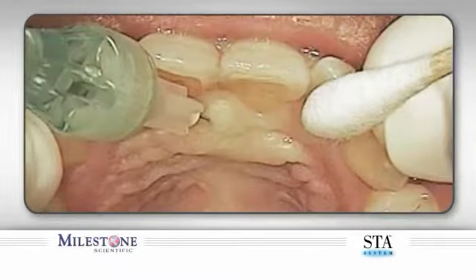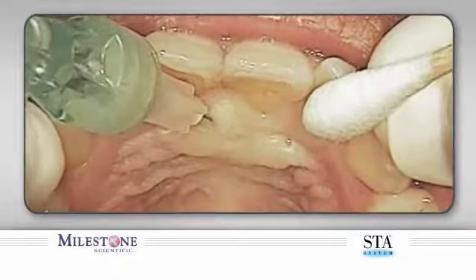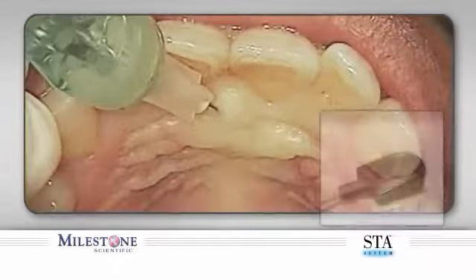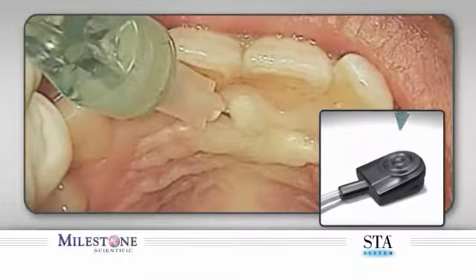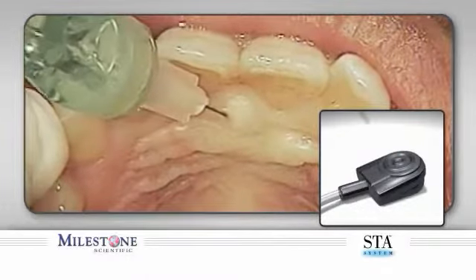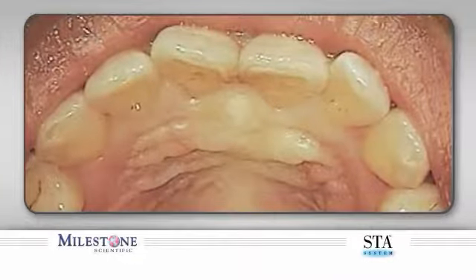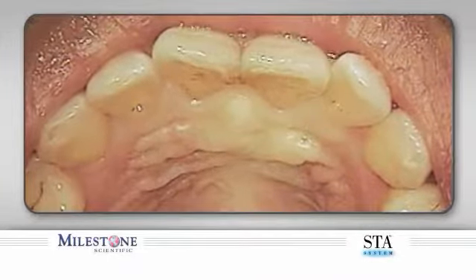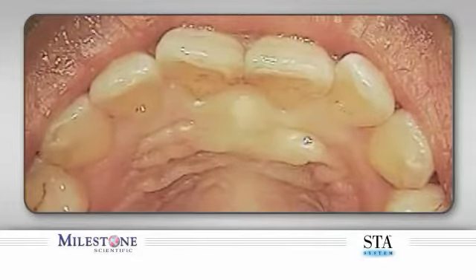To avoid anesthetic sprayback during needle removal, use the following removal technique. While the needle is still embedded in the patient's tissue, depress and release the foot control pedal. Count 3 beeps after releasing the foot control pedal, and then totally remove the needle from within the patient's mouth. Direct the needle away from the patient, as a small amount of anesthetic solution may still be present.